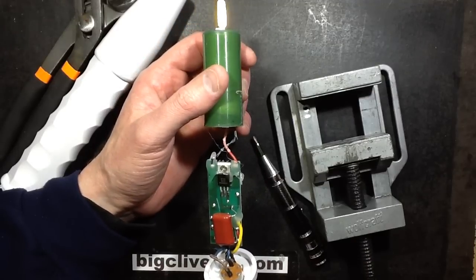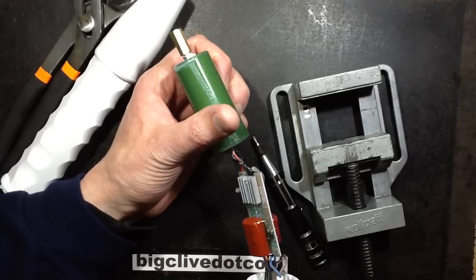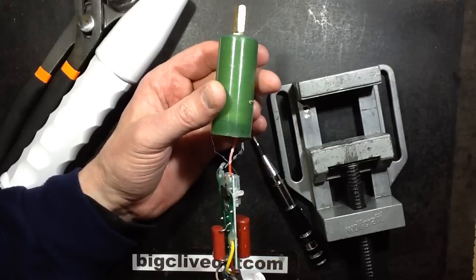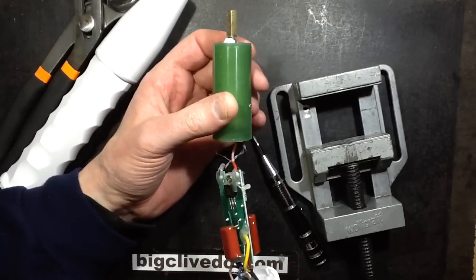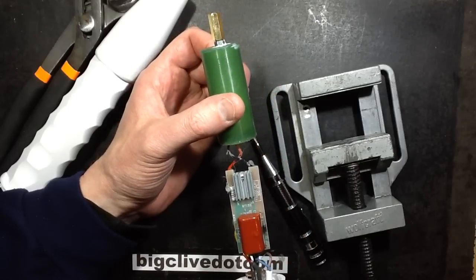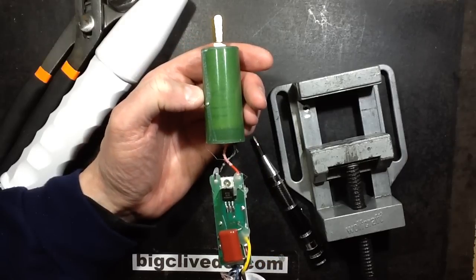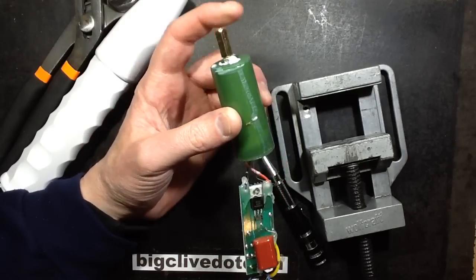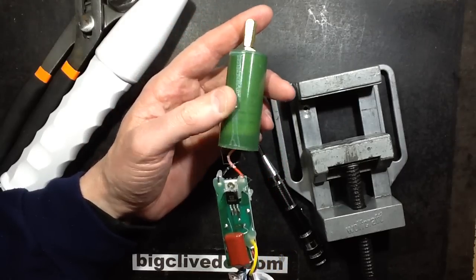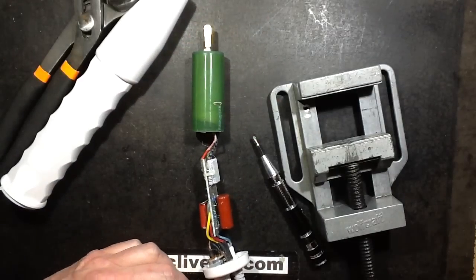I'm guessing this is just going to be almost like a triac dimmer. Oh, this is kind of pleasing, actually. BT152. Sounds like a triac. Okay. Right, well, I'm just going to pause momentarily and reverse engineer this.